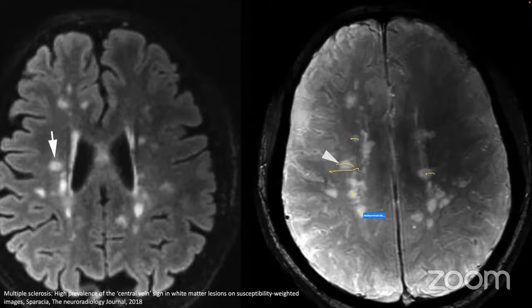This one is another example, because some veins travel radially across the cerebral hemisphere, so not necessarily on the long axis or the plane of your axial scan. So maybe this one is a central vein as well. But virtually speaking, or pathologically speaking, every single lesion has a vein around it in MS.